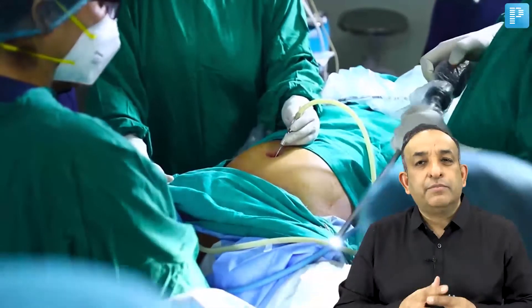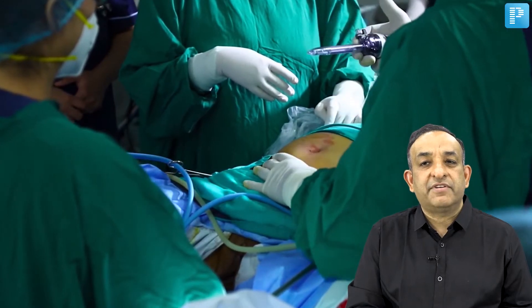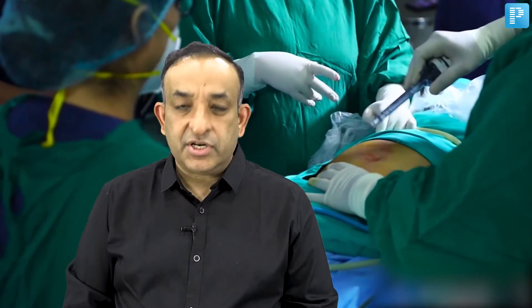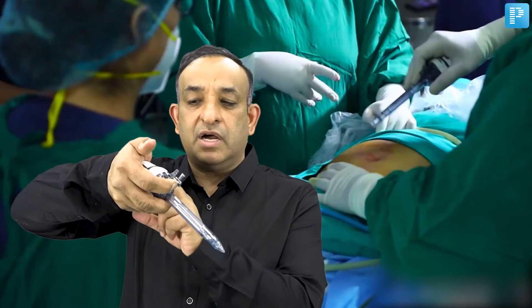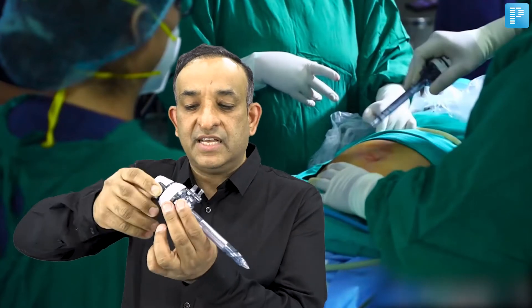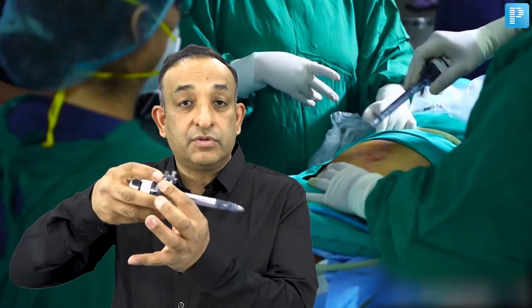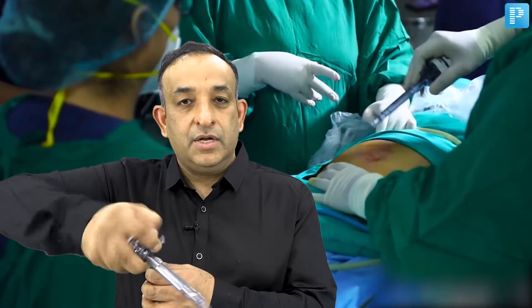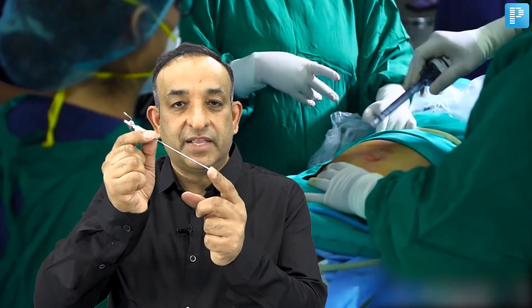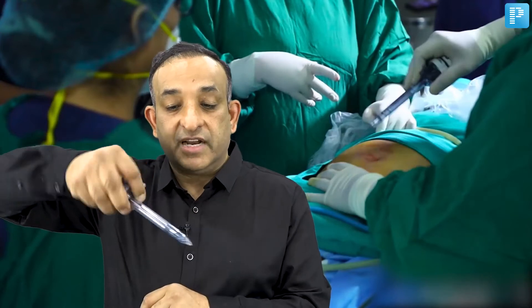After insufflation and white balance, the next step is to put a trocar and cannula. I hold the trocar differently from the Veress needle — with the back of the trocar resting against the palm of my hand — because this has movable two parts and I don't want the trocar to withdraw when going through the tough abdominal wall. I push the trocar and cannula in a corkscrew manner, unlike the dart-hold used for the Veress needle.